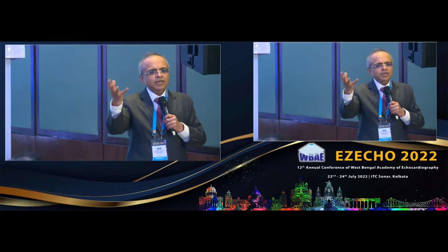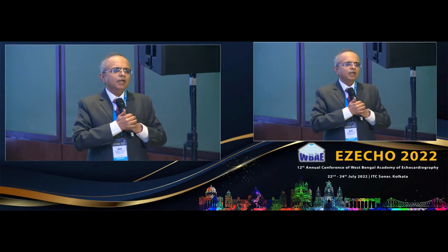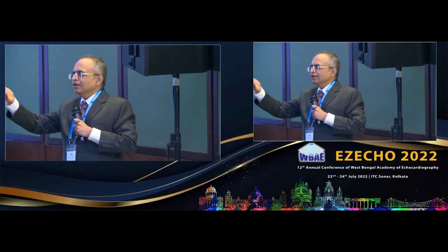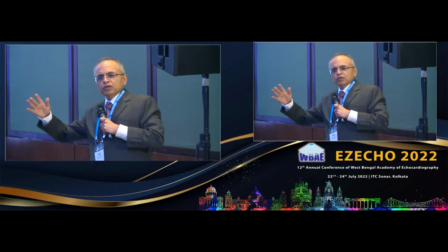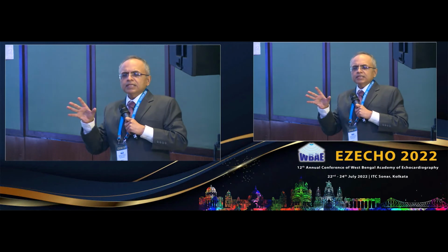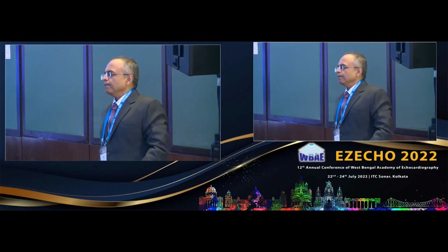Then look at the DVI for the mitral valve, and if it goes above 2.5, you know that definitely this effective area is as low as 1 probably. Okay, and that is because we said now when it is already 2, that means it is already halved of the LVOT area. So it is already 1.5. So it is 2.5, that means it is already gone nearer to the 1. So that is how it is. So all these things, even looking at the Dopplers carefully, is very important.